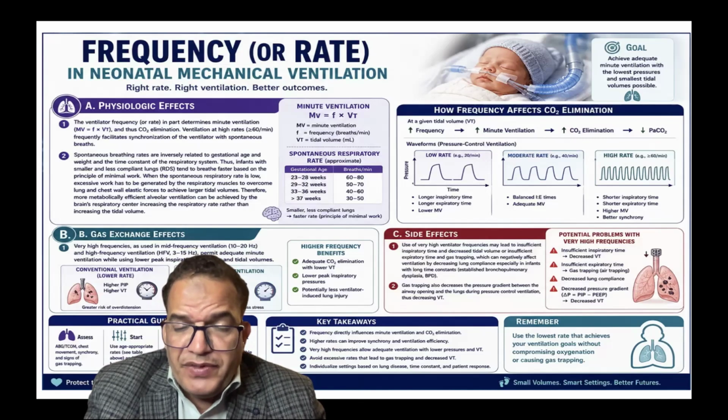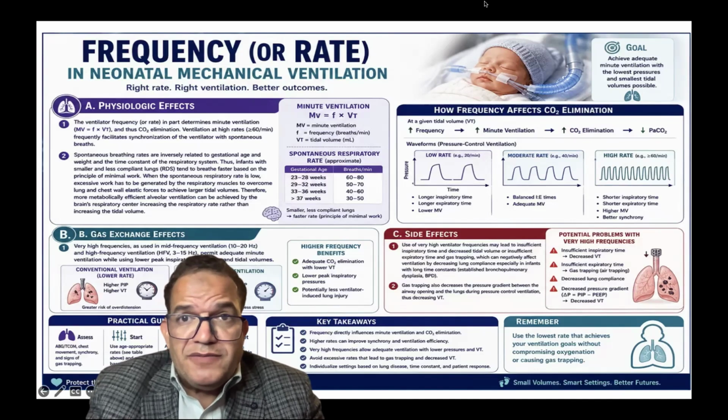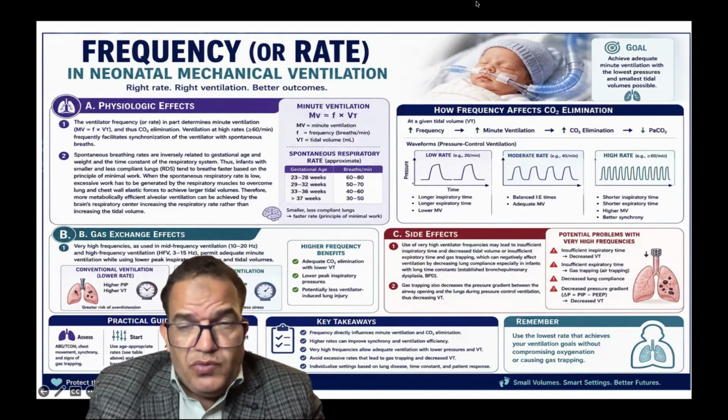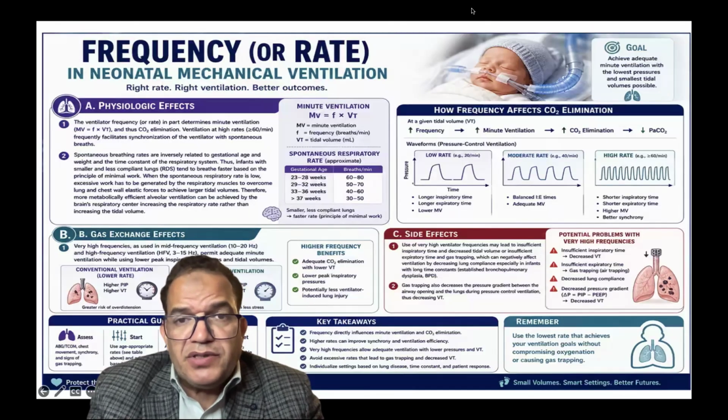And also, when you put a baby on a setting, not all babies are similar, and not all diseases are similar. So every lung disease has its own setting, its own time constant, and patient response. This is my first lecture for the tools. Know your tools, and we'll talk next about the inspiratory time.